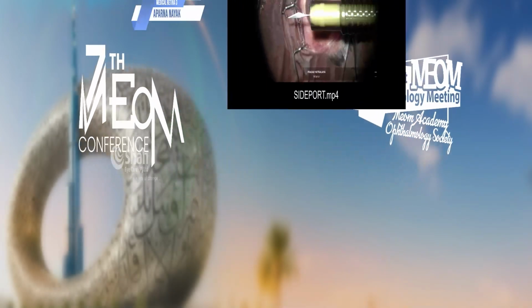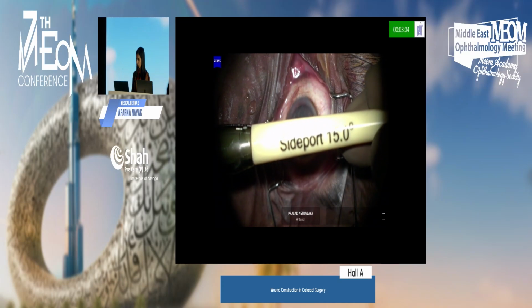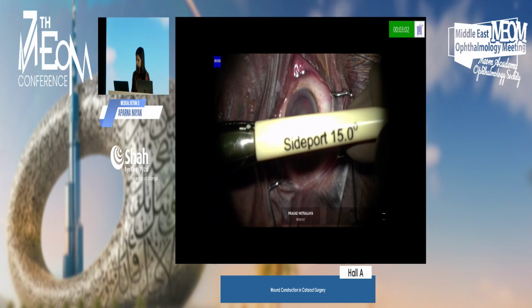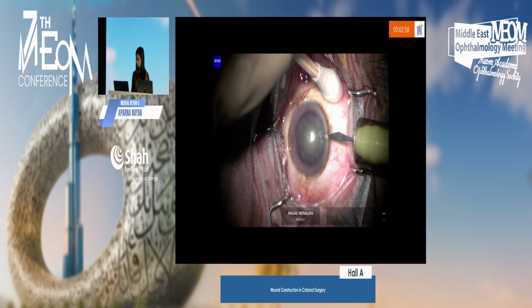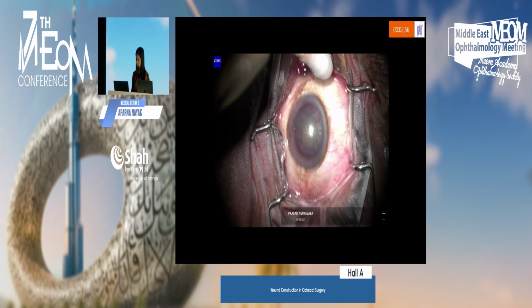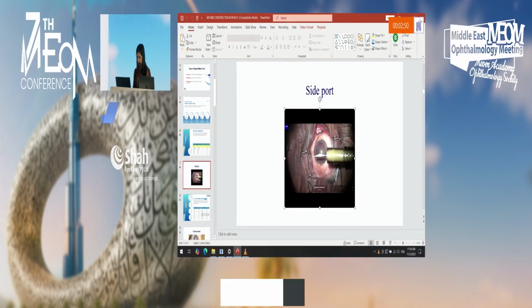Yeah, so this is the video of the sideport blade that we use. It's 15-degree. This is the one that we use for our phacoemulsification. So let me just get back to the presentation.